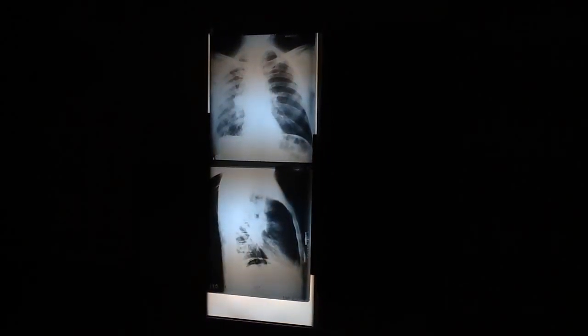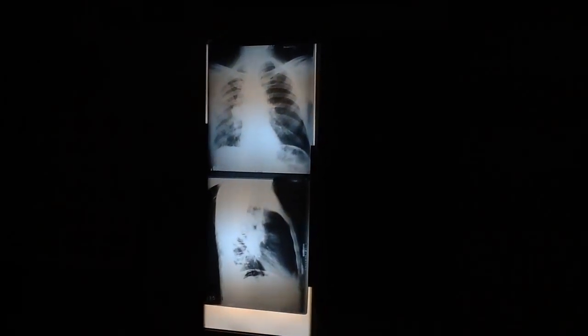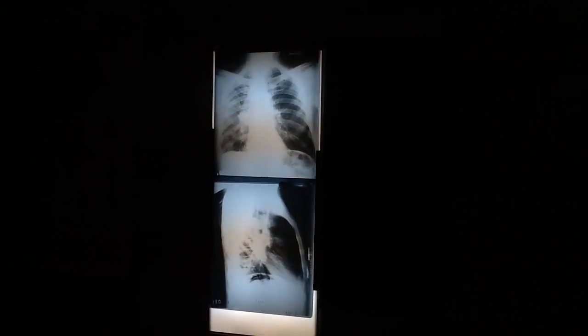Unilateral enlargement of a hilus, which we said could be from 2 things. Either central tumor enlarging the hilus or lymphadenopathy. Yeah, lymph spread, exactly. So we can have it from the tumor or we can have it from lymphadenopathy. Number 3 was mediastinal widening.